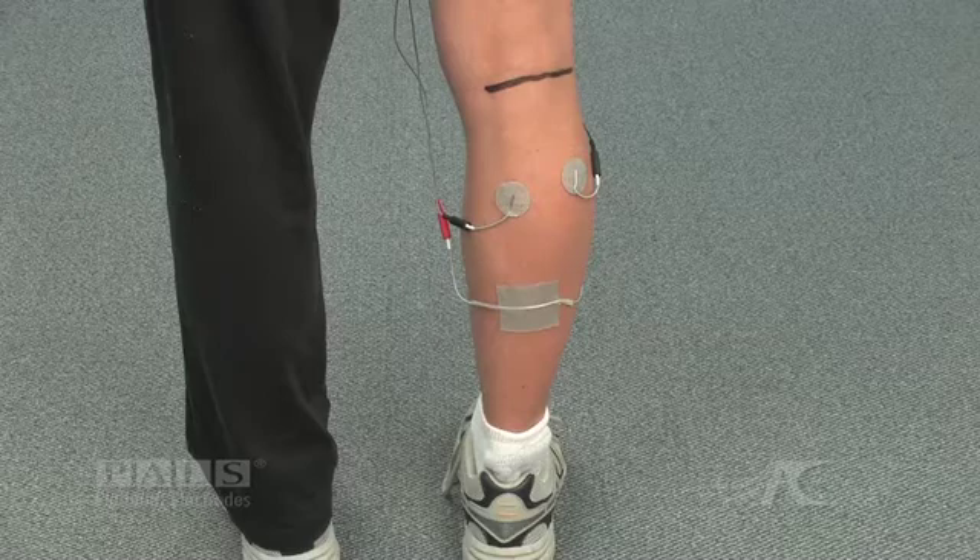The popliteal fossa is marked. An asymmetric waveform is used. The negative electrodes are placed over the medial and lateral gastrocs.